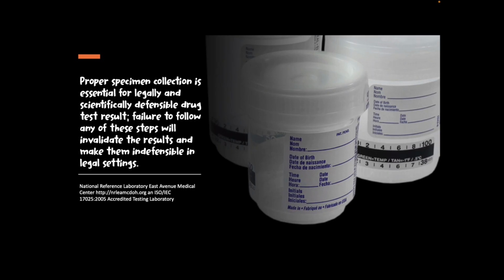So this one states that proper specimen collection is essential for legally and scientifically defensible drug test results. Failure to follow any of these steps will invalidate the results and make them indefensible in legal settings. I agree with this, because this is not only true for drug testing but also for the other tests the medical technologists conduct in the laboratory.